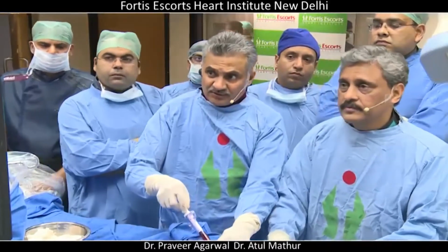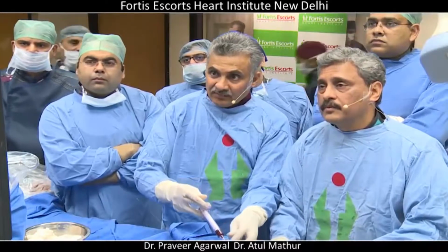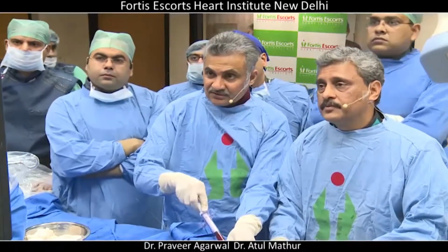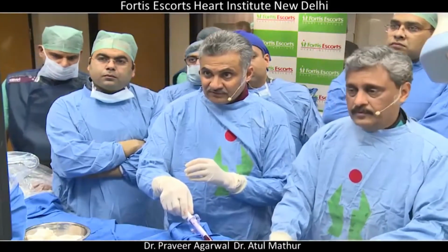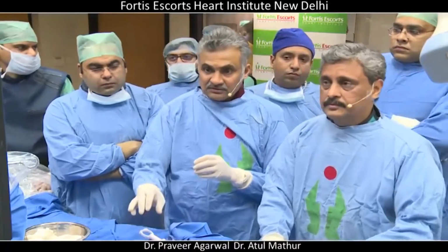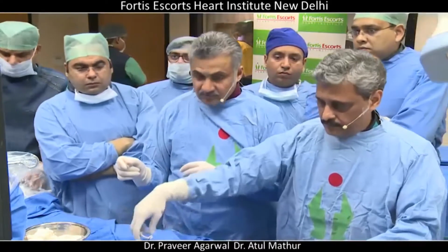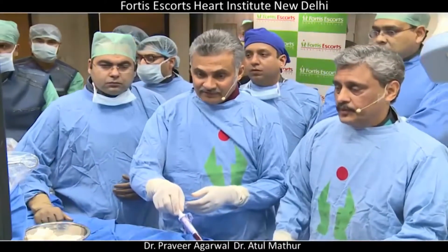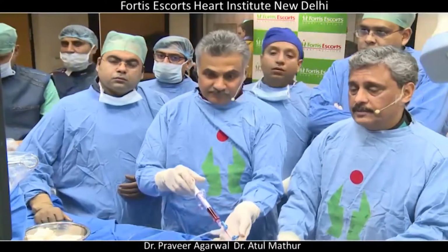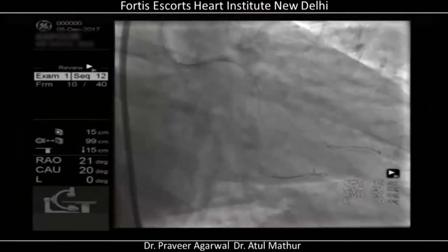The angiogram shows slightly more. Yeah, go up, go up, please. 6, 7, 8, 10, 12, 14, 16, 18. Deflate. Can we have this angio on the screen? Live at me. Okay, take a picture. Some room is there now. Yeah. Let us try the cutting again.